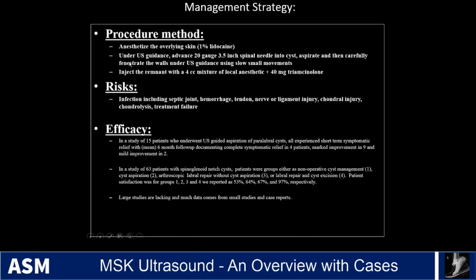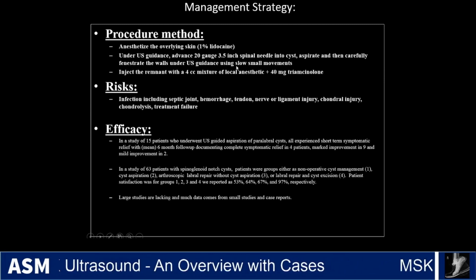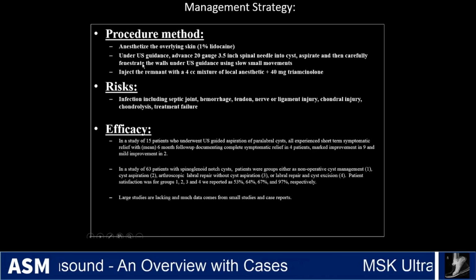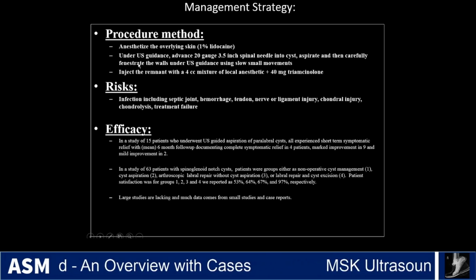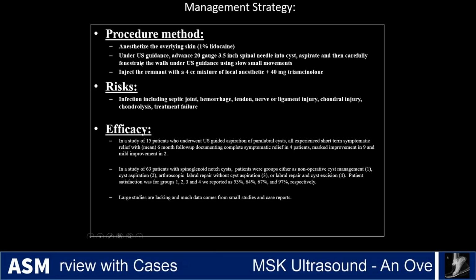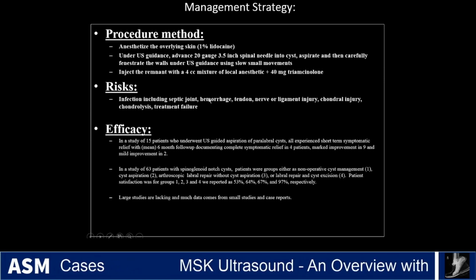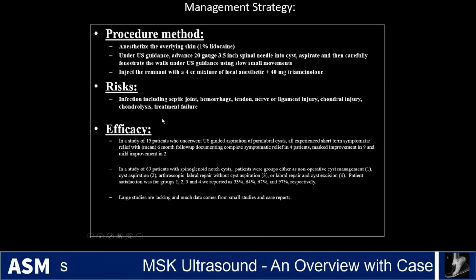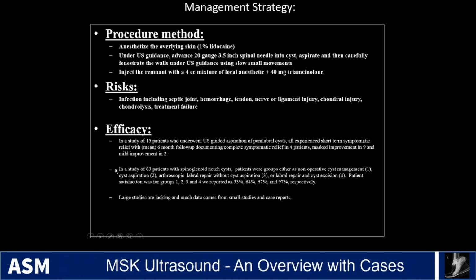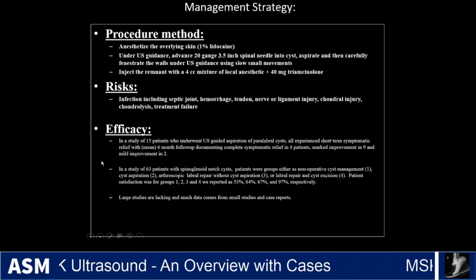And some people will advocate for carefully under ultrasound guidance fenestrating such cysts, poking holes through the walls to try to avoid the ability of it to reaccumulate fluid, and potentially to cause a little bit of a bleeding response so that in theory the cyst walls may scar together. And then you may inject the remnant with some steroids. There are risks associated with it, and here is just a couple of lines about some of the studies describing the efficacy of this procedure.